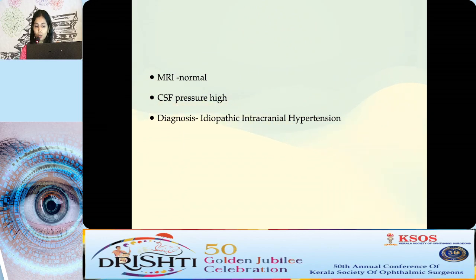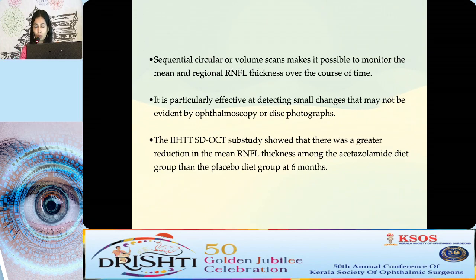The diagnosis is idiopathic intracranial hypertension. So here the use of OCT RNFL is not for the diagnosis, but when you are treating the patient, the sequential scans make it possible to monitor the patient, to know the response and when to stop the treatment. And it's also effective in such cases where we're not very sure whether the optic disc is thickened or not. It would confirm the thickening.